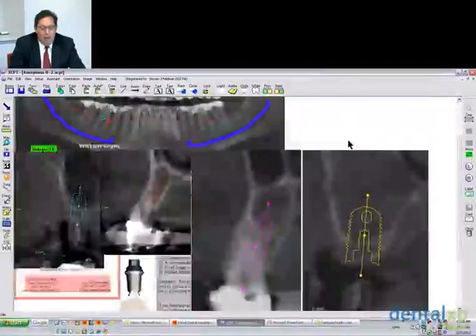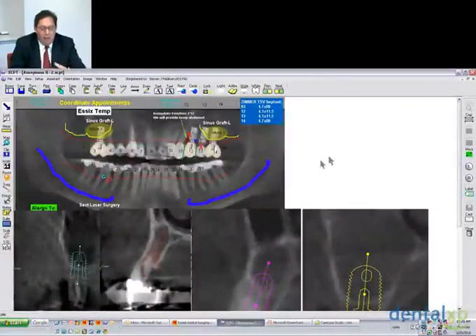So when I'm about to go into surgery, my staff has actually taken all these pieces, placed them out there. I don't have to go back in to the DICOM and take a look at what I'm doing. I've already got it here documented on my paper. Now, the reason for this is twofold. Number one is I can go into the surgery and don't have to go in the DICOM. The other reason is a little bit more, I think, complicated.